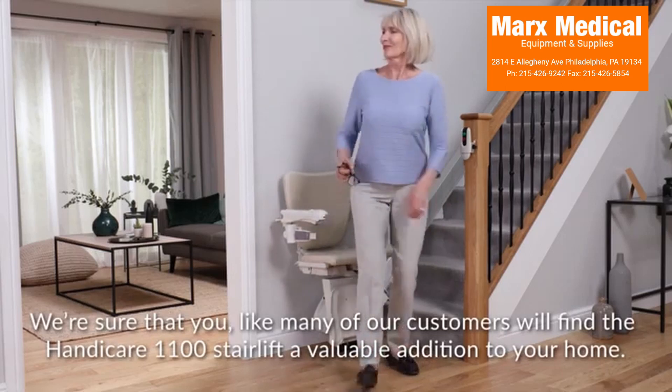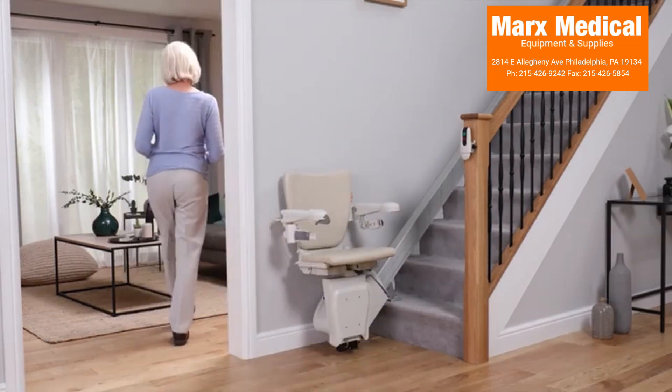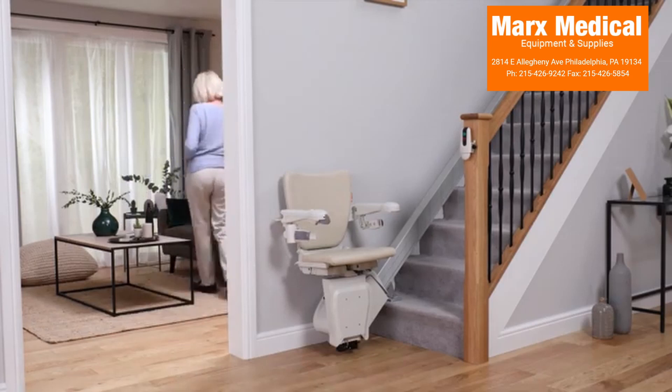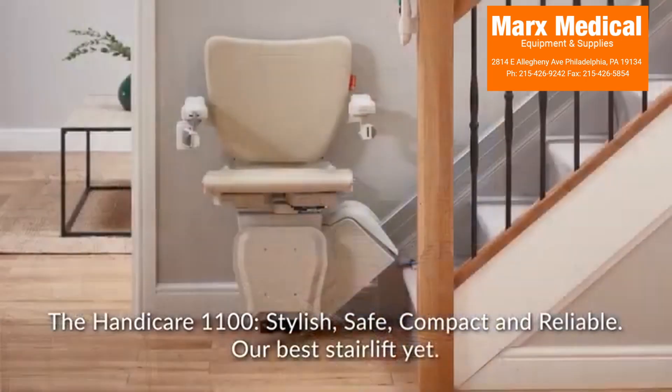We're sure that you, like many of our customers, will find the Handicare 1100 Stair Lift a valuable addition to your home. The Handicare 1100 — stylish, safe, compact, and reliable. Our best stair lift yet.